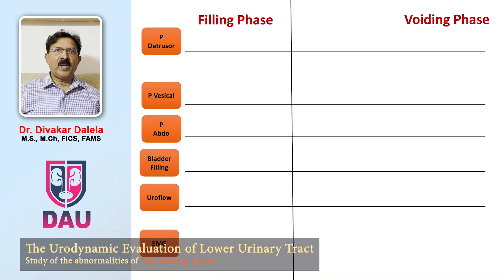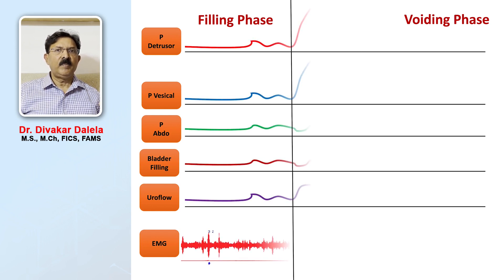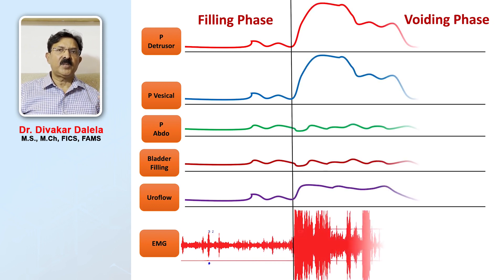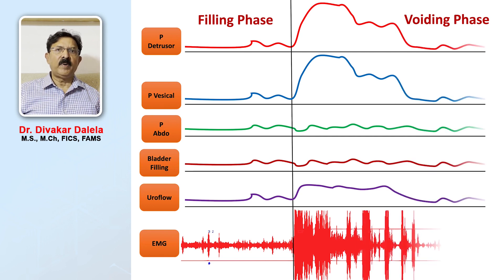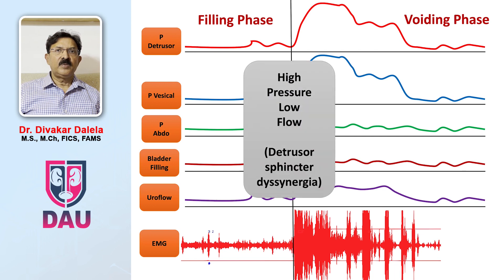Now look at this study again — you will also see an EMG line at the bottom. In the filling phase, you notice some sphincteric contractility to maintain the bladder. As you give the voiding command, the pressure flow lines show elevation and the uroflow line shows low Q-max, but the sphincteric activity shows high spurts. So here is a case where the sphincter, instead of relaxing, is contracting during the phase of voiding — that is the reason for low Q-max. This condition is high pressure, low flow, due to detrusor-sphincter dyssynergia.